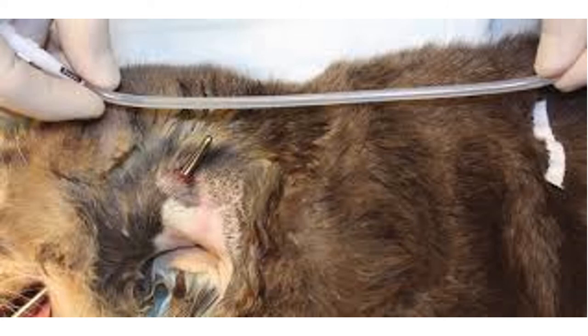In this picture, you see that the incision was already made on the lateral neck area. The tips of the forceps are already protruding out, and it is ready to grasp the tube. But let's slow down and find out the step-by-step procedure for esophagostomy tube placement in the next lecture video.